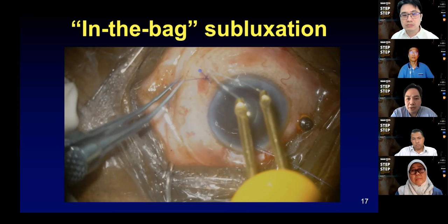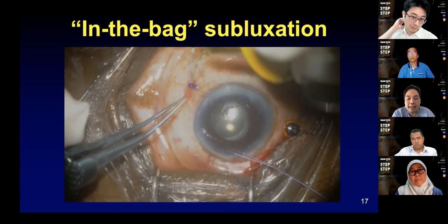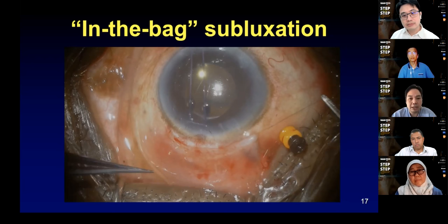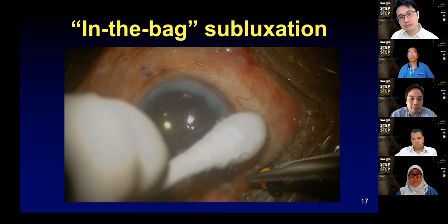One of the things I found is that you have to create some tension on that suture, because you're trying to hold the haptic in place. You can't have it too slack, because after you create the bulb, everything might just sag back inside, since the inside part is not pulled taut. As you see here, my colleague is finishing off the conjunctival closure, and you get a nice coverage of the bulbous ends of the Prolene, and the lens looks pretty secure and centered.